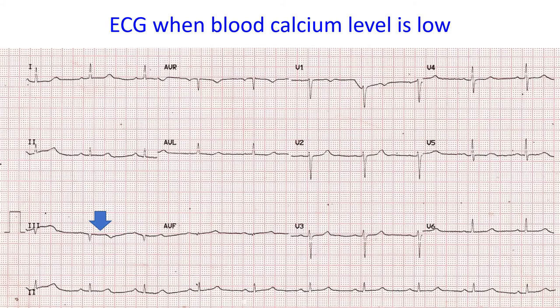ECG can be abnormal when electrolyte levels in blood are abnormal. Important electrolytes in blood which can affect the ECG are potassium, magnesium and calcium. Potassium and calcium are involved in the ionic currents which generate the electrical signals of the heart. Magnesium is important in regulating the levels of calcium and potassium by enzymes involved in transfer of these ions across the kidney.